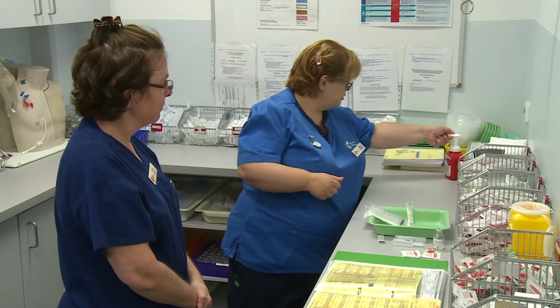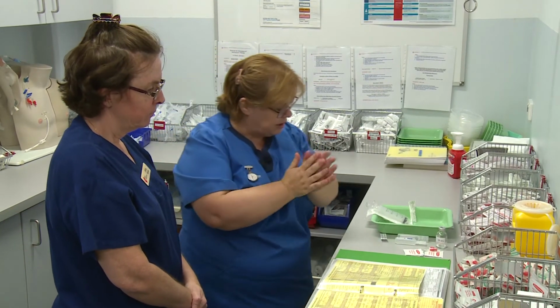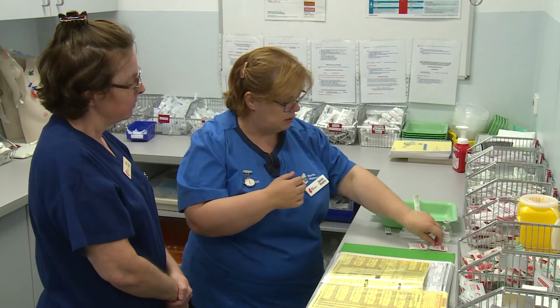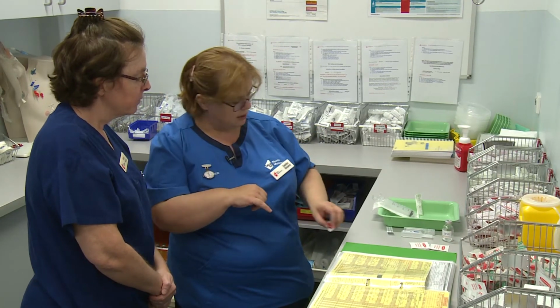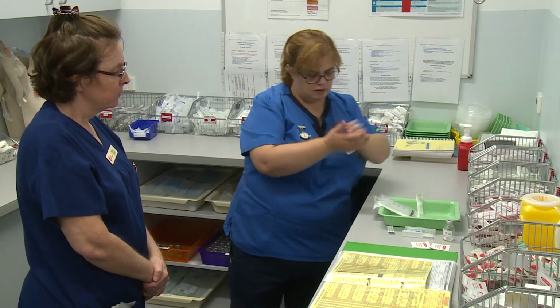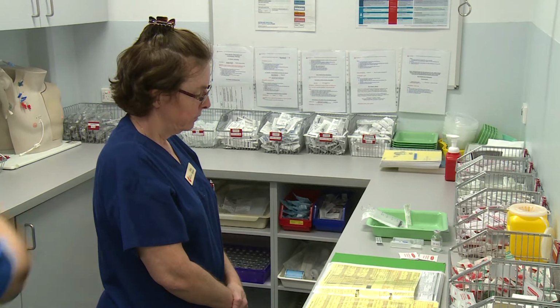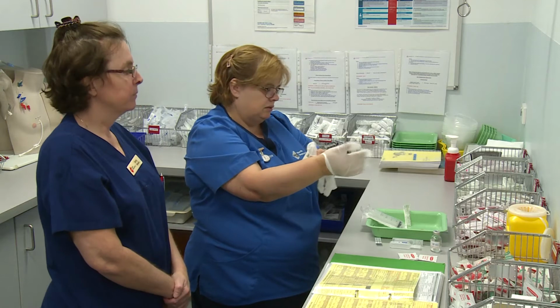Okay, now I've prepared that, I'm just going to do some hand hygiene again, and then I'm going to put some gloves on. I also have a red bung to put on my syringe at the end. And I'll just check the integrity of that. So the expiry is 2024 and it's intact. So that's ready to go. I'm just going to get gloves. Pop these on.